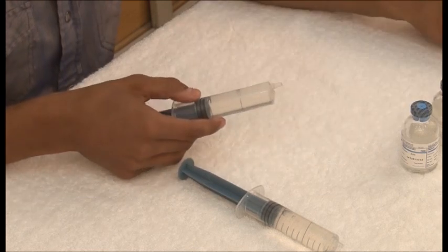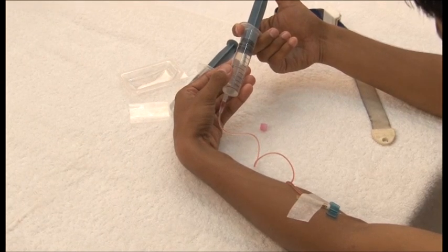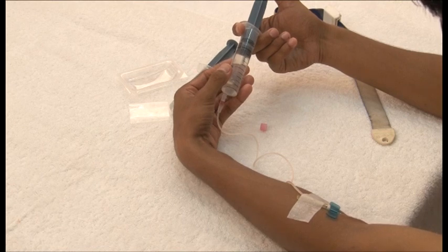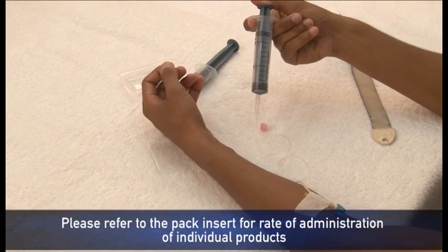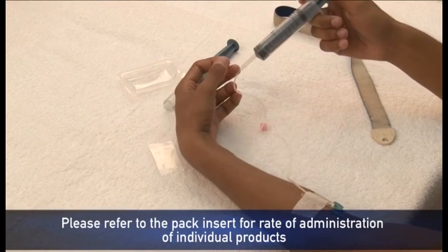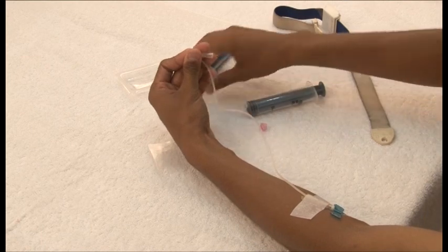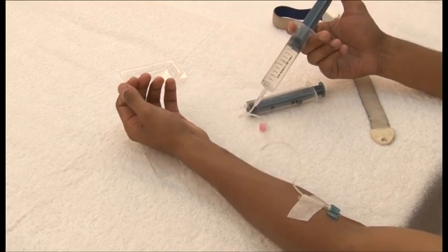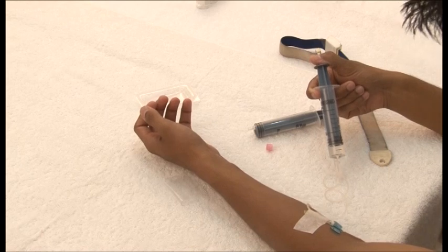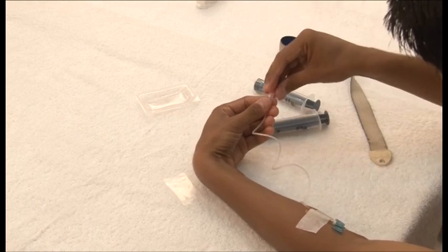Discard the filter needle and connect the syringe to the tubing of the butterfly needle. Now infuse the factor, checking the backflow from time to time. Once all the factor has been infused, remove the syringe from the tube and cap the end of the tube with the stopper.